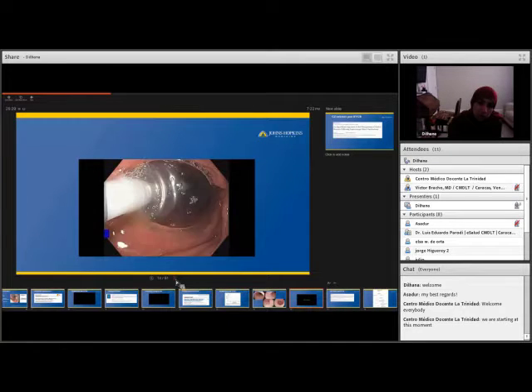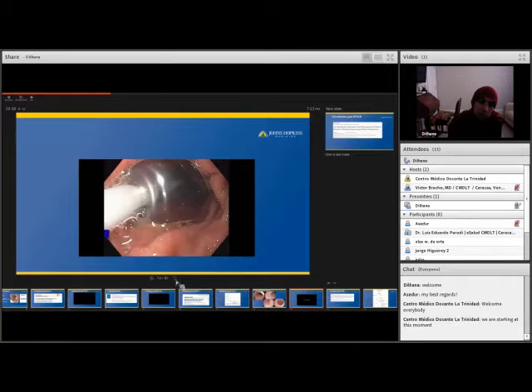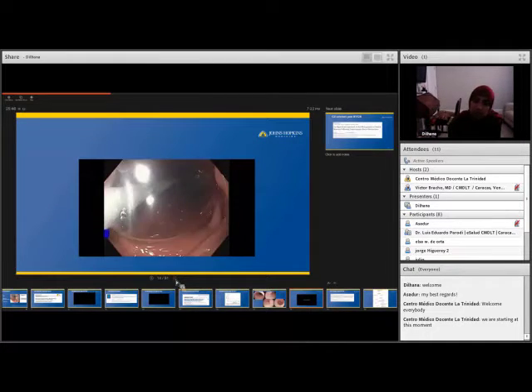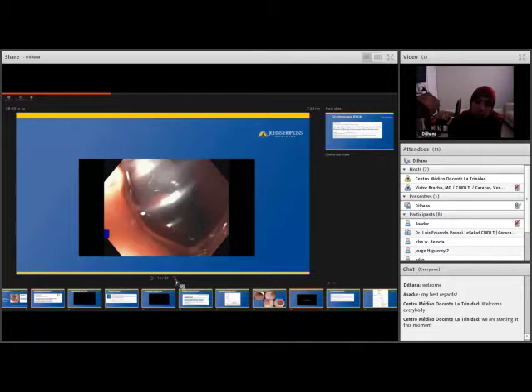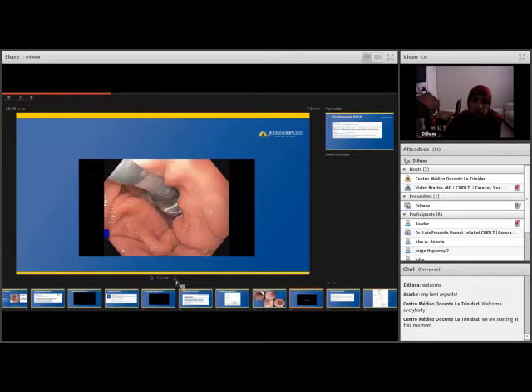And you can hold the dilation anywhere from 1 to 3 minutes. So you have to watch carefully to make sure you don't perforate. If the balloon is too close to the pylorus, then the risk of perforation increases. And these strictures are often at the incisura. That is where you often see this narrowing or this tortuosity. So you want to look carefully through the balloon so you can look at the tissue as well as the muscle and just make sure that you aren't causing a perforation. You will see some bleeding and you can see a blanching of the tissue, but you shouldn't see opening of the tissue so that the muscle layer is visible. Then you've dilated too much.